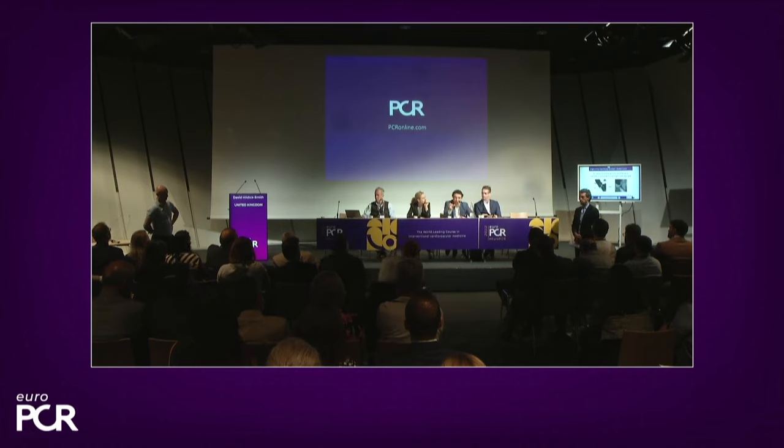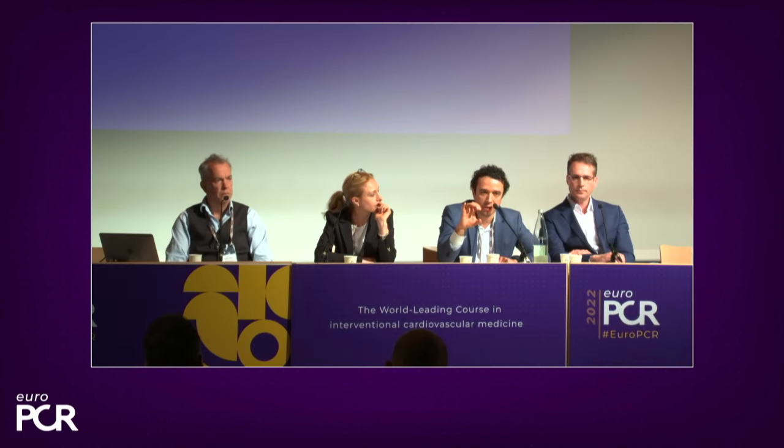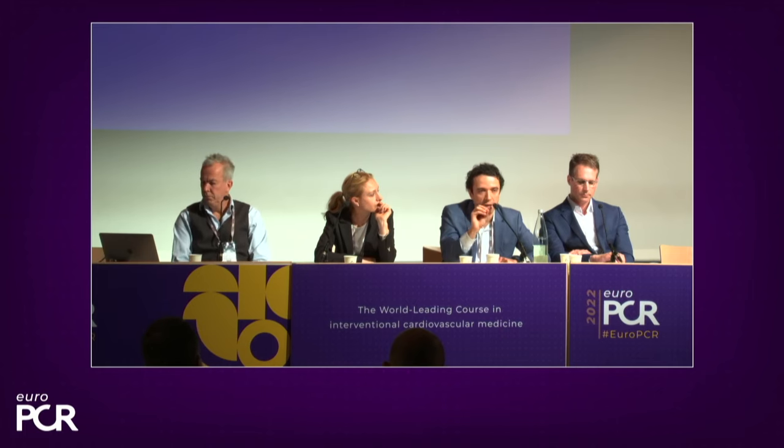Well, the patient has a very narrow, as David showed now, very narrow STJ, low coronary takeoff. I'm not concerned with acute occlusion in the procedure, but what's going to happen down the road? So all of these factors must be taken into account when we're deciding what to do with this patient. Our responsibility as operators has increased dramatically when we're addressing these patients, and we should, as a heart team, take all of this into account.